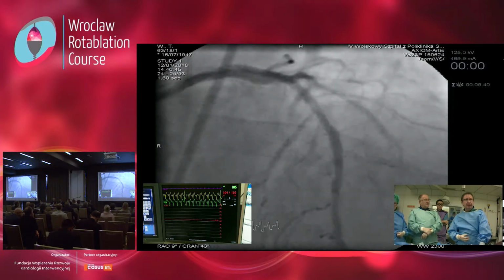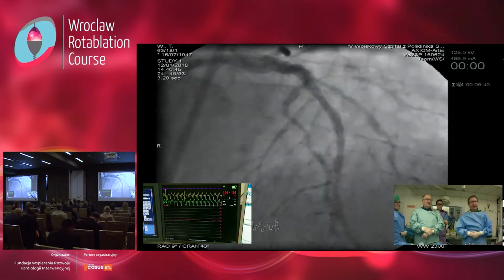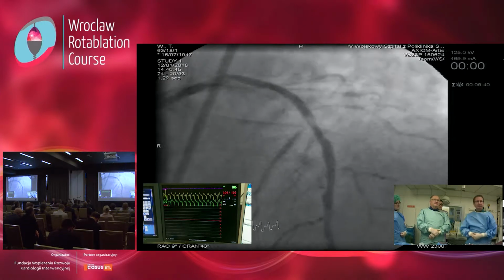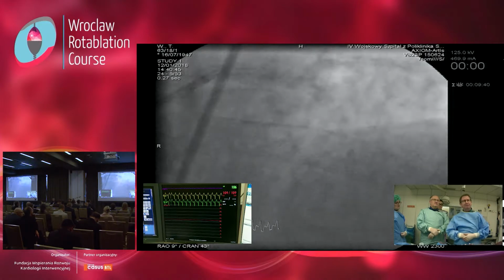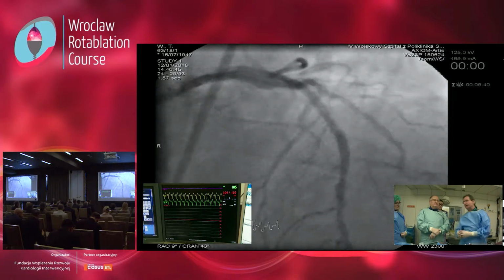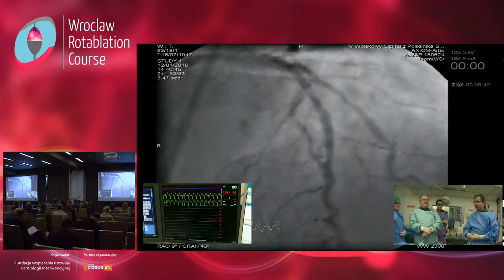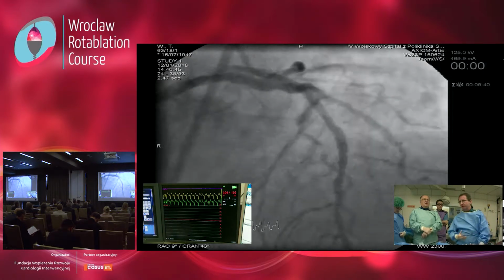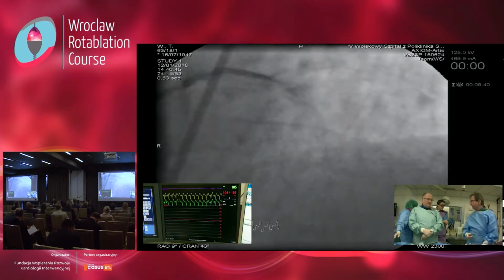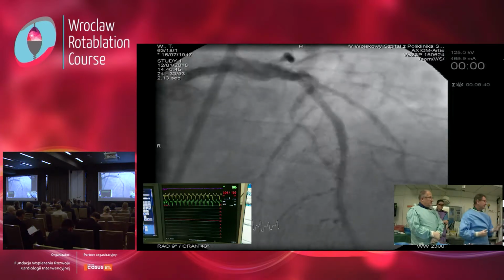But first, we can go now with a first long stent to the mid part of the LAD, and then on the way back, definitely we will use a 3.5 short non-compliant balloon with higher pressure, and then we will see. But before we do this, we put a wire to the circ just to protect the circ, because if you have retrograde dissection to the left main, you could have big problems, left dominance here. So can we have now the longest 3.0?